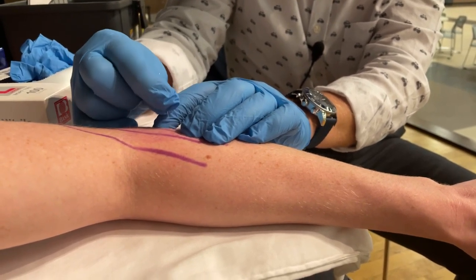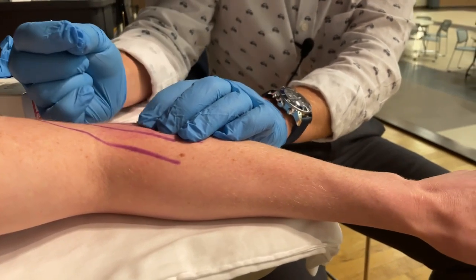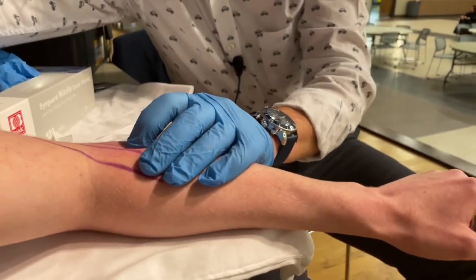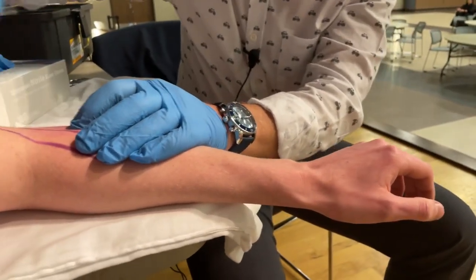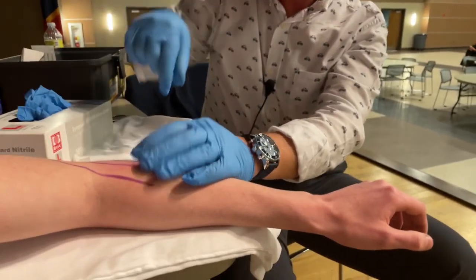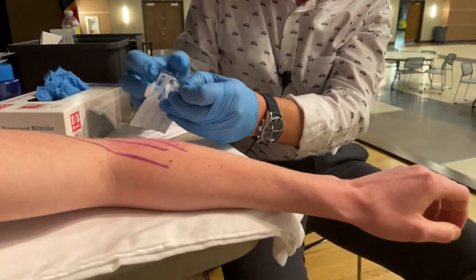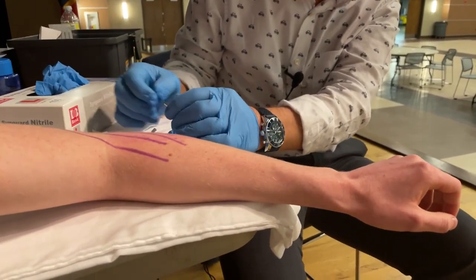Needling 101 — I was just distracted and let a needle fly. That is terrible. How much do the needles cost? They're pretty cheap — within the cents range, like 20 cents a needle or something like that. So you may use 10 needles per session.